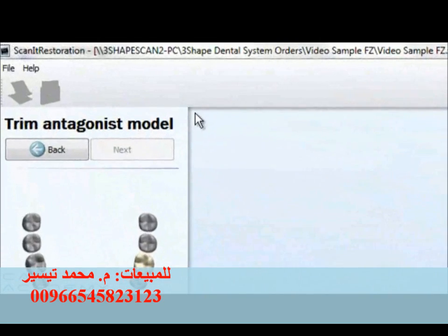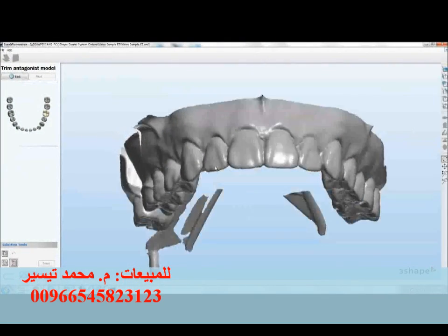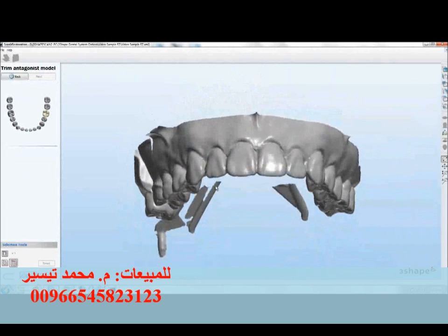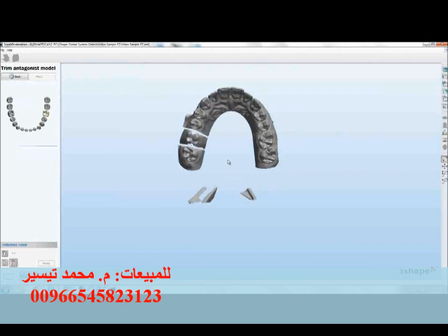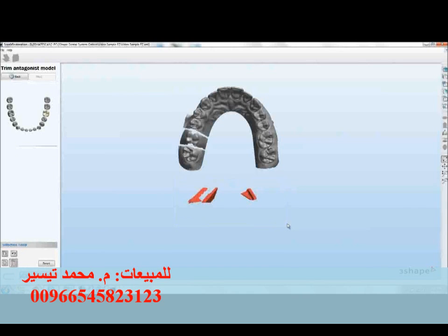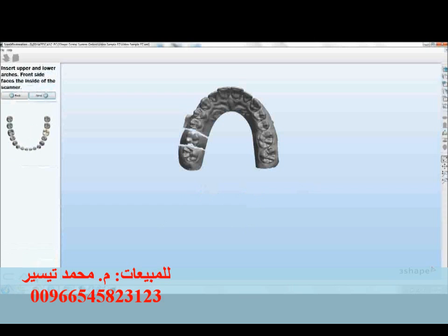We're also being asked to trim the antagonist model — a step to get rid of some unnecessary material. In this example, we've got some of the articulator visible, so we're going to draw a square around that area, just as we did for the previous selection, and hit apply. We'll see that area disappear. Go ahead and hit OK. Now that we've already inserted the upper and lower arches, we're ready to go to the next step — so we'll click next.